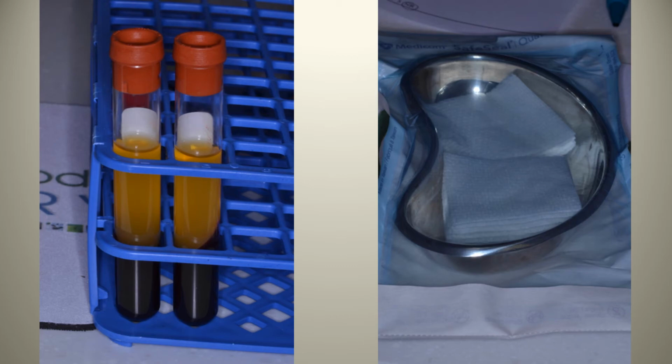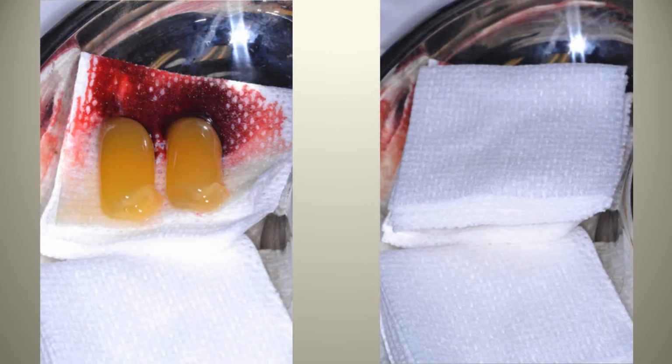We also have these kidney basins, which we sterilize with gauze inside them for the production of our PRF membranes. I don't use a PRF box. So what we usually do is take the snot clots or the little platelet-rich fibrin clots out, put them onto a sterile piece of gauze, and put another piece of gauze on top of them. This photograph here basically just demonstrates the whole technique.